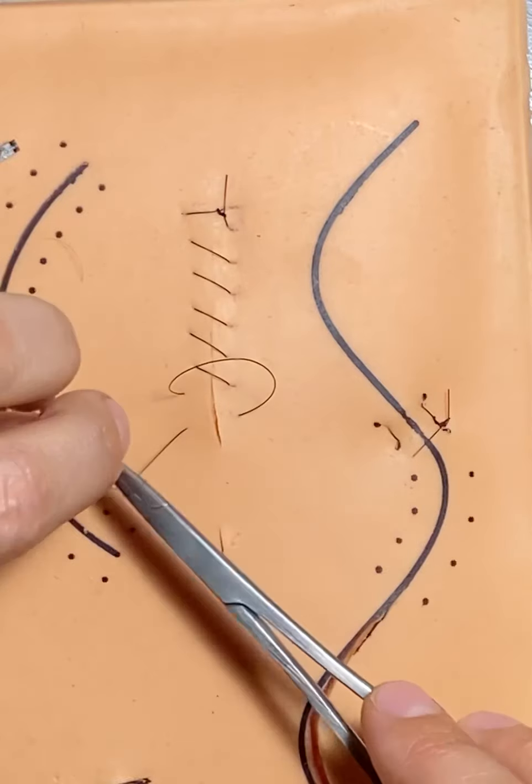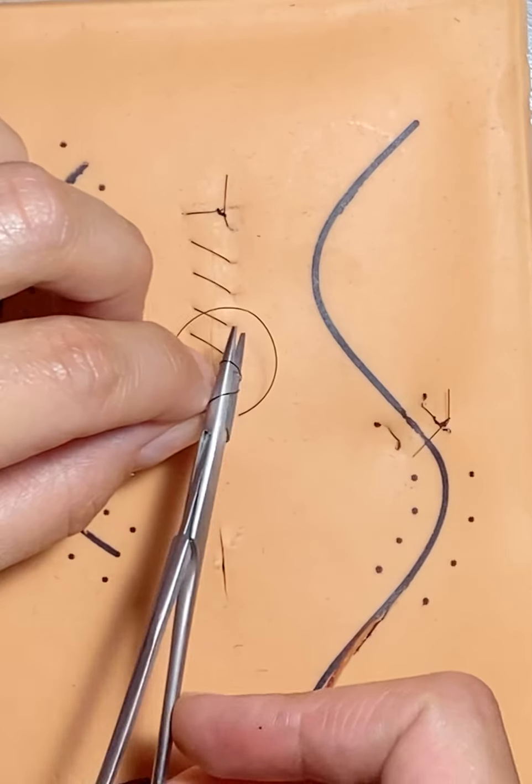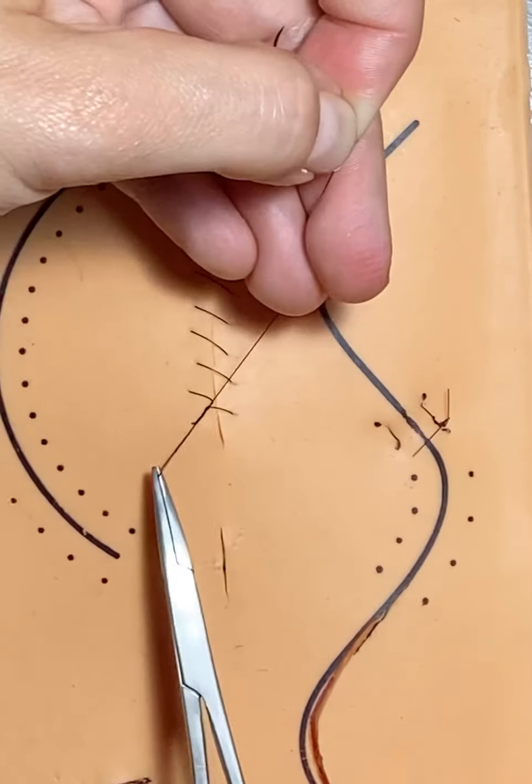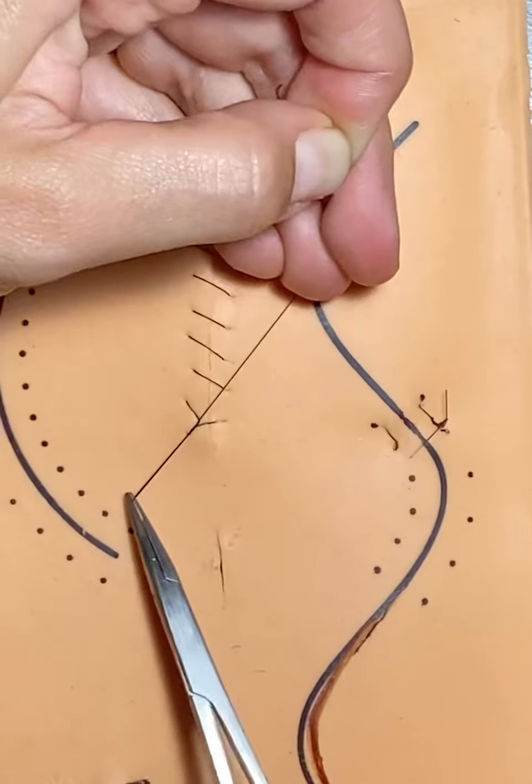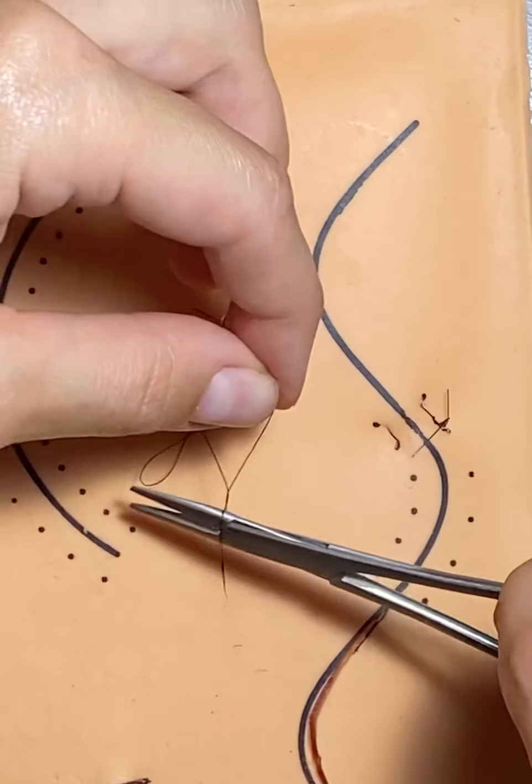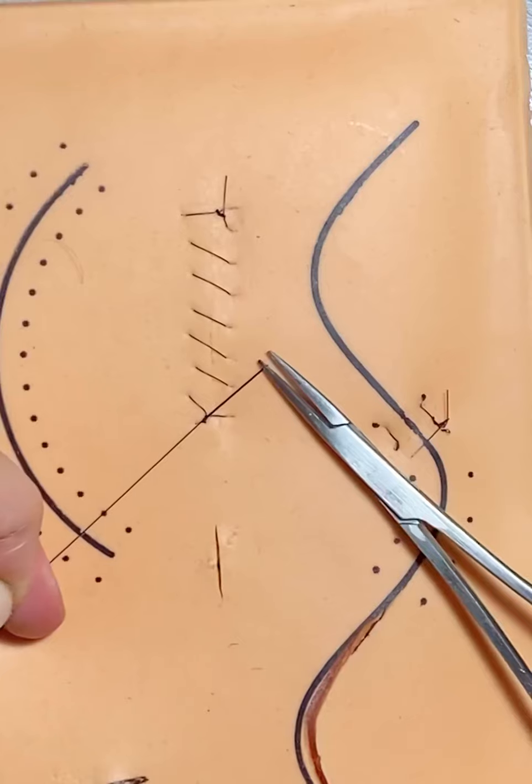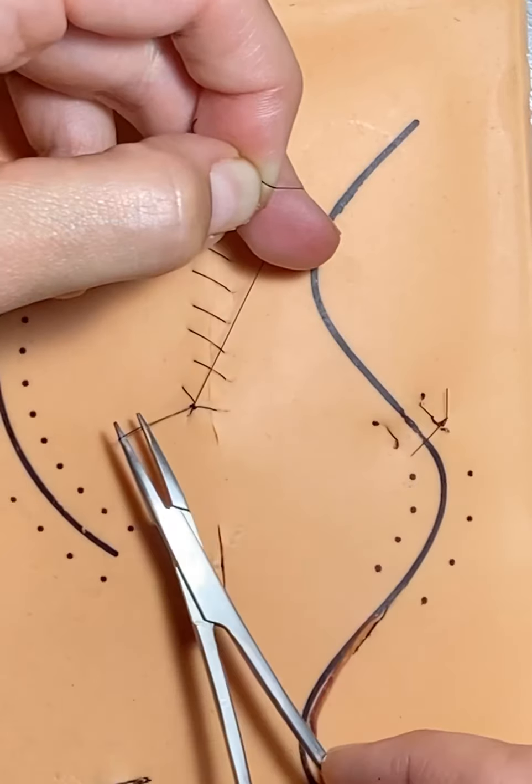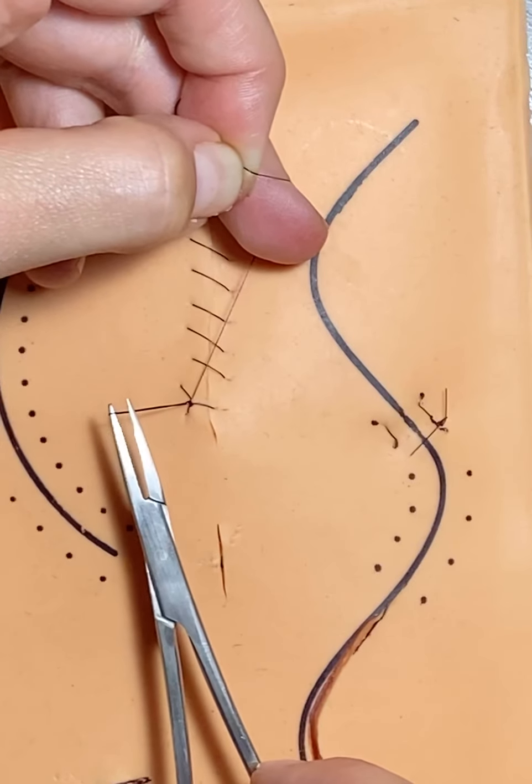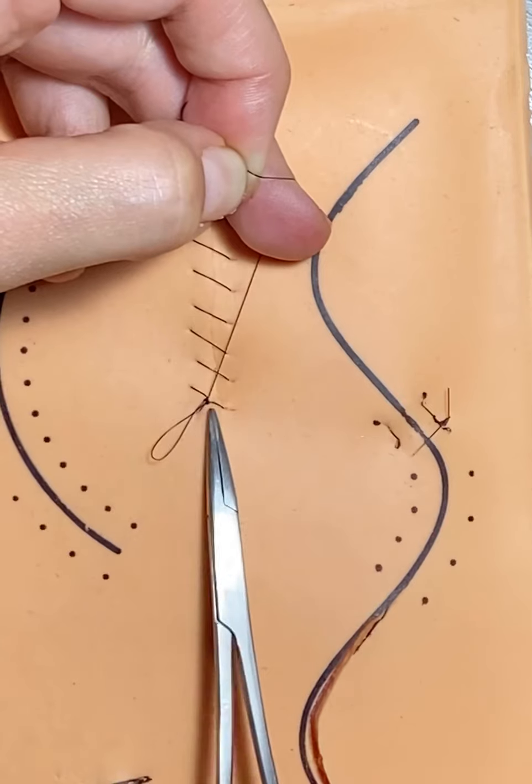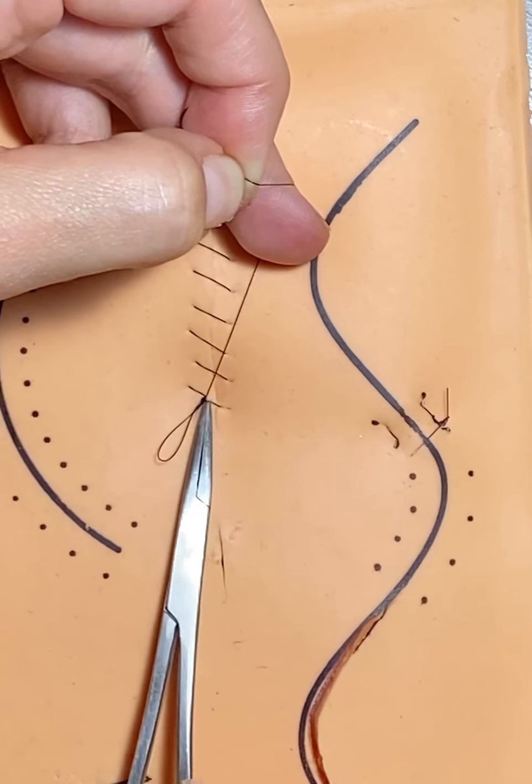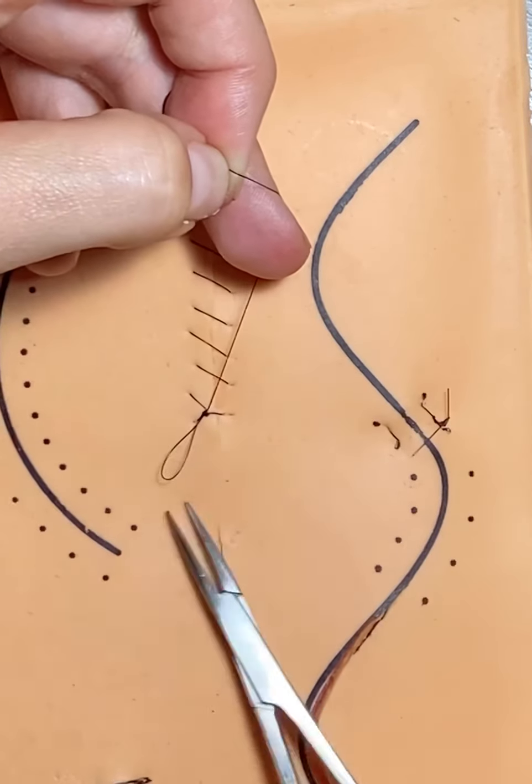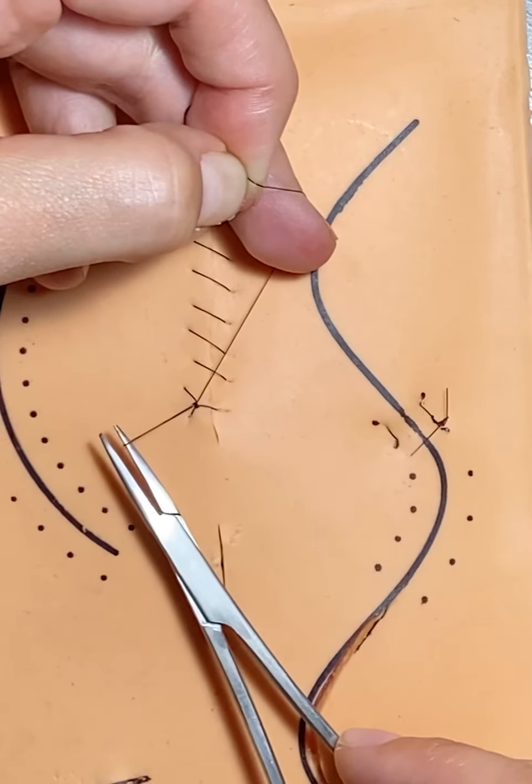So there's our two throws for the surgeon's knot. Grab our tail. See how it will lay flush down. Grab our tail again in the opposite direction. When you're pulling your loop, always do it with an open needle driver because if the knot doesn't pull through evenly, you might have like a little bunny ear in the knot, and that will go away if you tug both sides of your loop or if you tug your loop with an open needle driver.